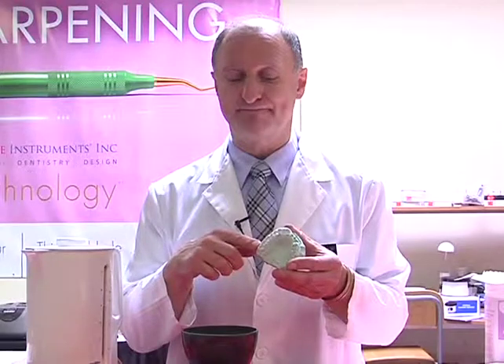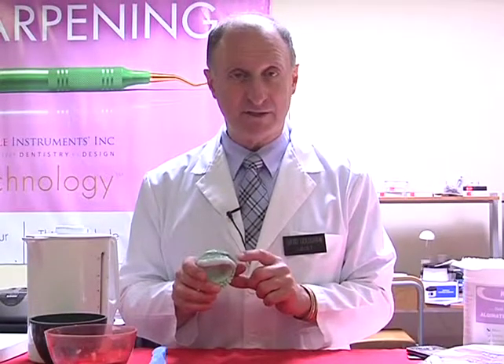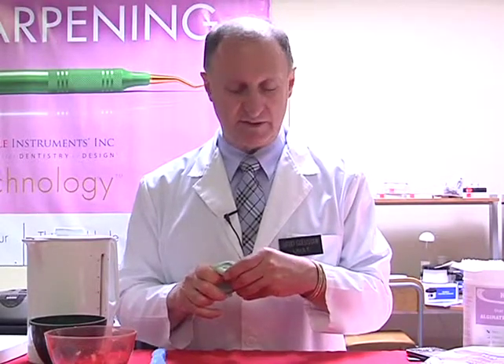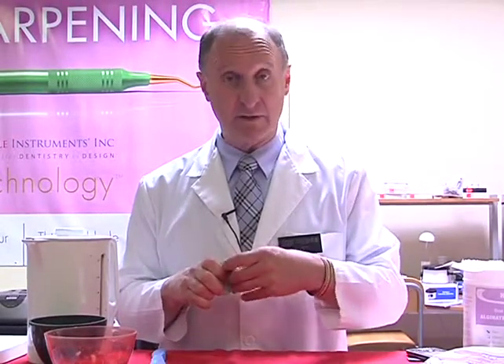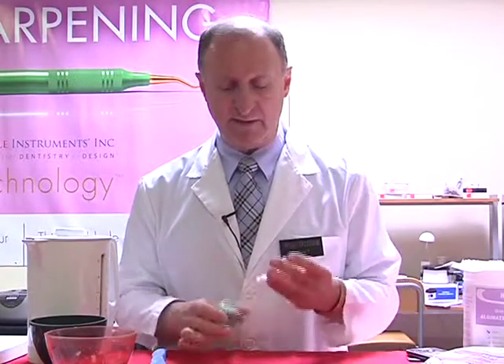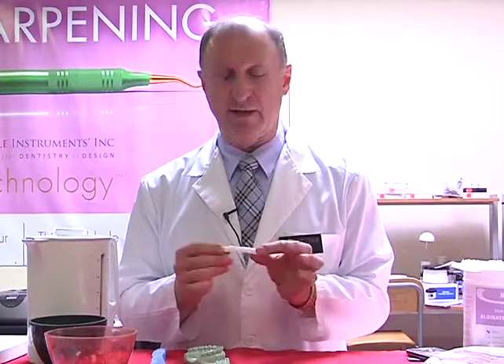It's very quick. So once the material has turned white, it's now sufficiently cooled, and we can then remove it from the patient's mouth. So with a light pressure, you'll notice that it does fit a lot tighter than a bleaching tray inside the mouth. So we remove it, and we're left with an easy material.